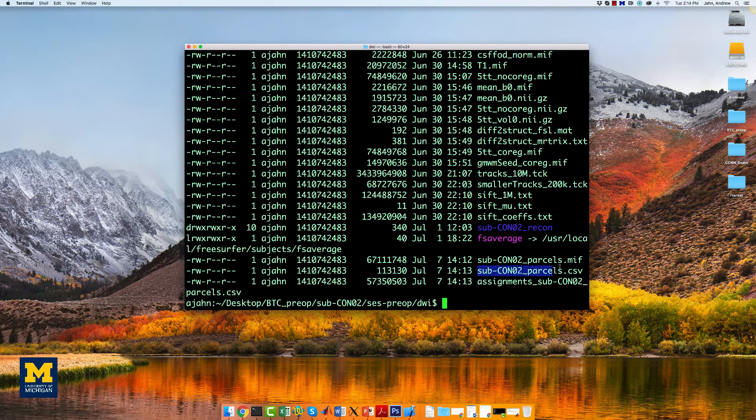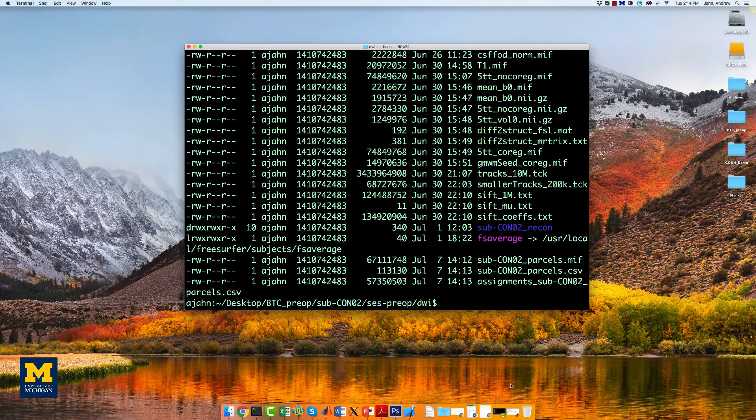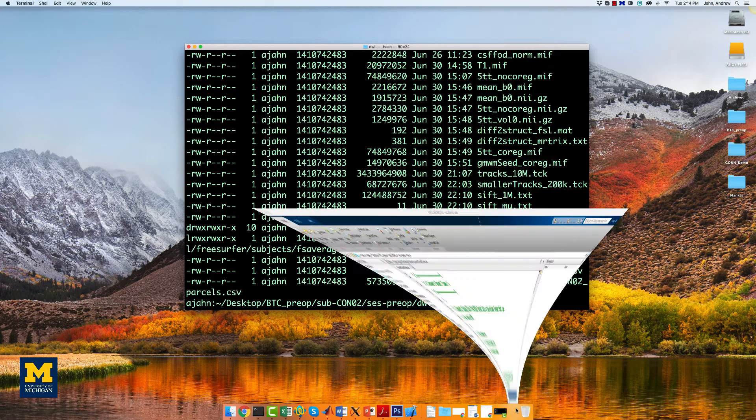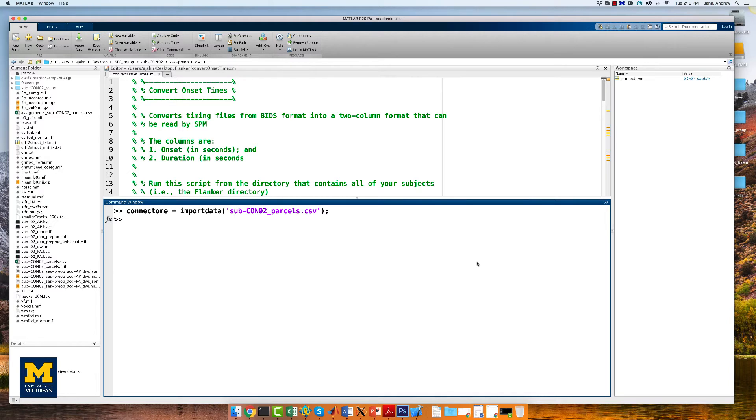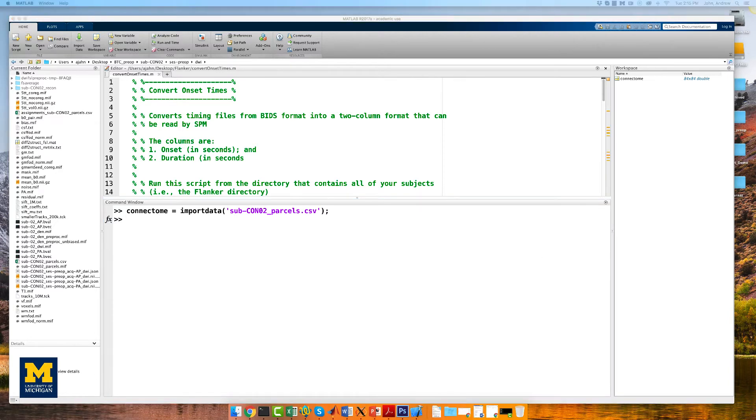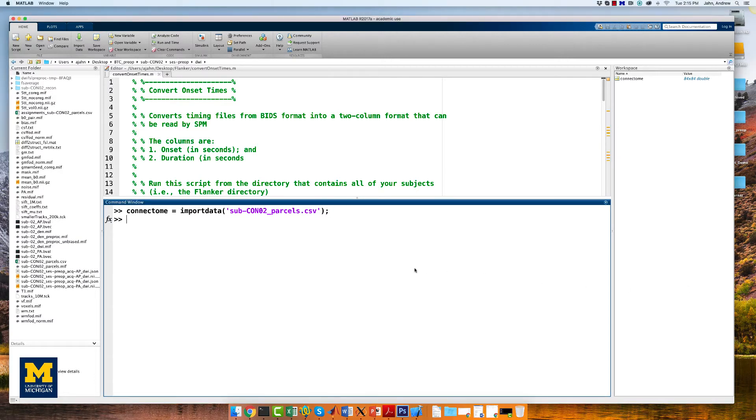First, you will need to open up MATLAB and then import this file using the import data command. You will need to view it as a scaled image so that higher structural connectivity pairs are brighter. To heighten the contrast, you can change the scaling of the color map with a vector. In this case, zero is the least bright and one is the most bright.